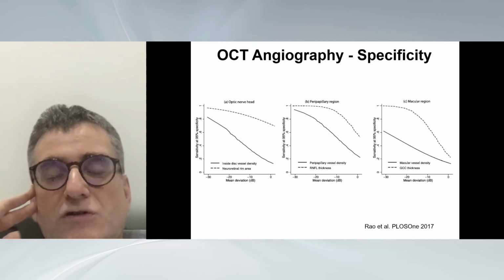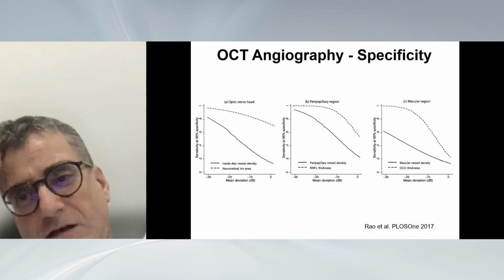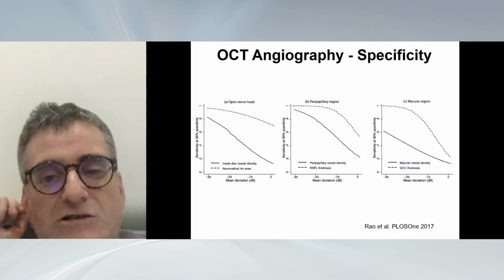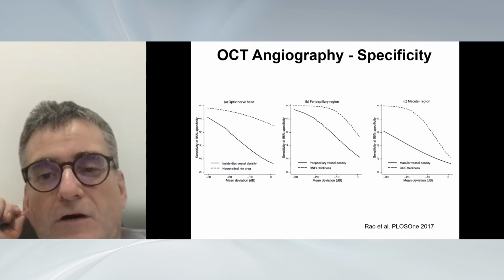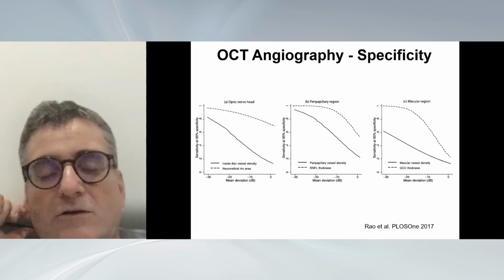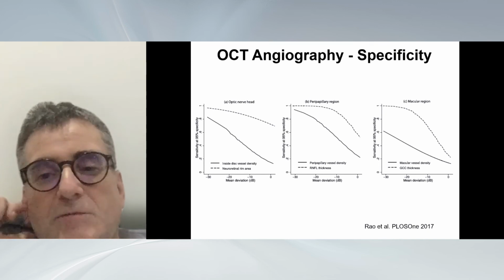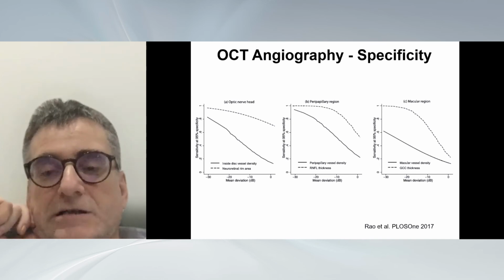Now, Natalia has also asked me to talk a little bit about OCT angiography. I think OCT angiography is still an experimental tool. We don't use it for clinical routine, but research-wise, it's still interesting. The reason why we don't use it for patients routinely is, on the one hand, that it's difficult to get good scans. And on the other hand, as you can see here, the diagnostic performance of the vasculature seems to be weaker than that of the structural OCT measures. Next.